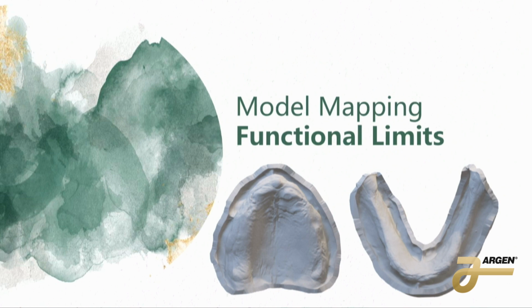Essentially, you don't need to carve it for every single patient, but for the ones that you do, you want to make sure that you're carving them the same every time. It's a nice standardized approach that we can teach in our lab, so all of our staff is doing the same thing across the board, right? We can do this digitally, but in the software, I'll be honest, it is a little bit tricky to carve it in by hand. You don't always know how deep it is. Sometimes you get little triangles or something like that.